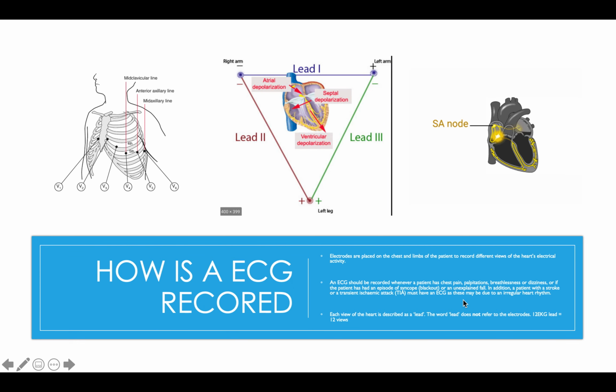So, how is an ECG usually recorded? Everyone knows that there is this 12-lead ECG, so basically it provides different views of the heart. Now the main thing and the fundamental point is what do you see on an ECG? What are these lines? What are these deflections, some of which are positive and some negative, some elevated and some depressed? What do these lines mean?